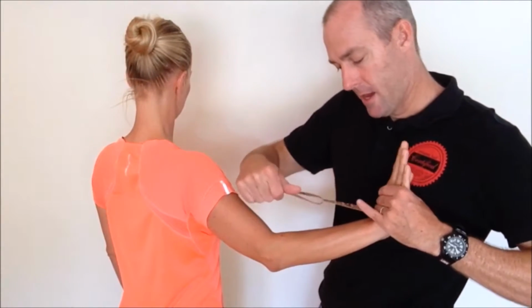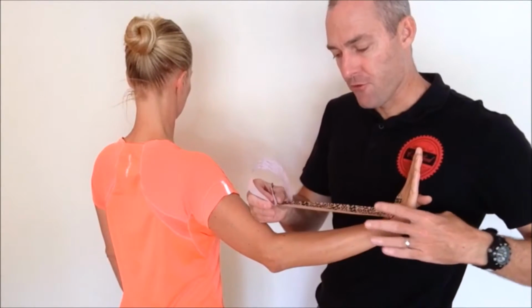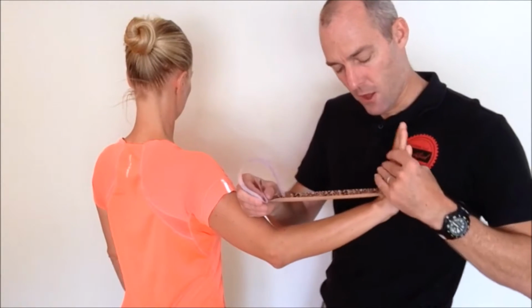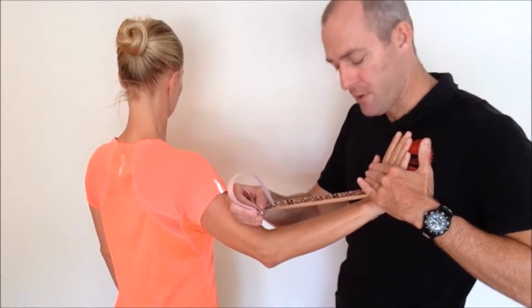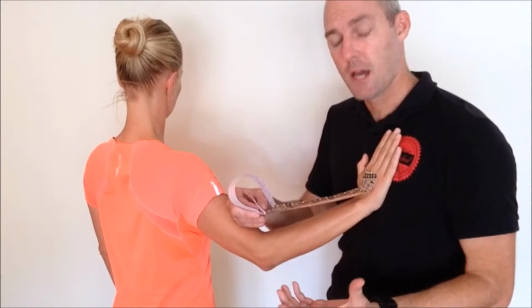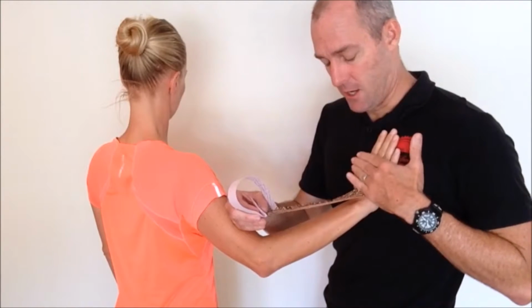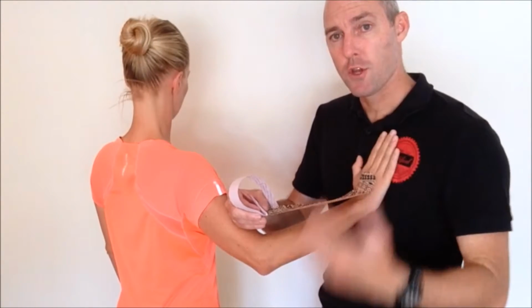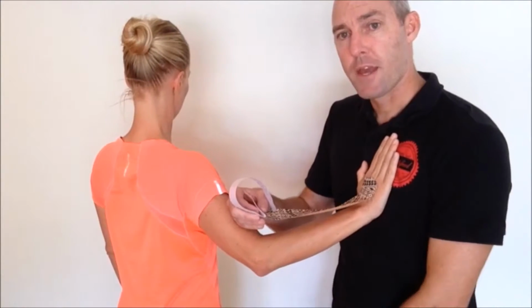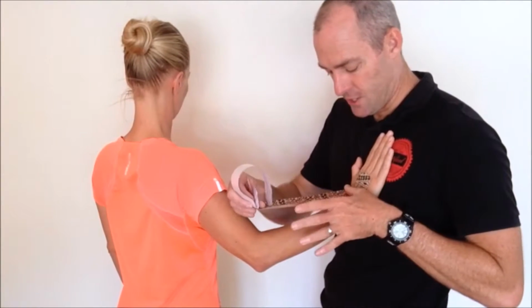So we would anchor there. Again, we would peel that backing paper off so we can take up uniform tension along the whole piece. So you don't lose your position, which is really critical. We need to contribute force into this system. We need to maintain that short position. Use your body. It might be your chest. You might be resting an arm on your shoulder. You might be pushing a foot up against your thigh to create your dorsiflexion, whatever it is. But you need to maintain your position.